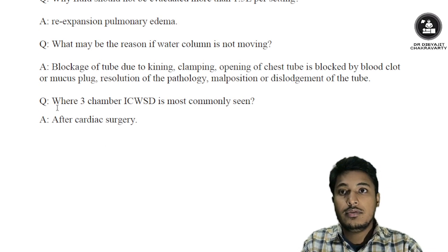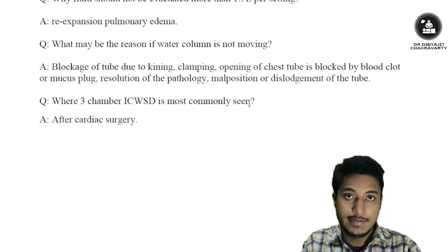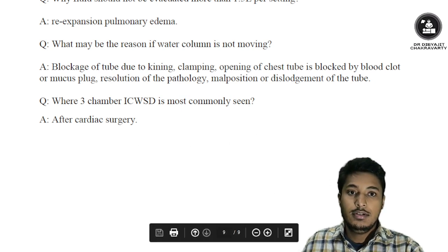And lastly, we may be asked about where the three-chamber intercostal water seal drainage is most commonly seen. It is most commonly seen after cardiac surgery, and so these are the things which we have discussed in intercostal water seal drain. Hope you have learned the topic very well.